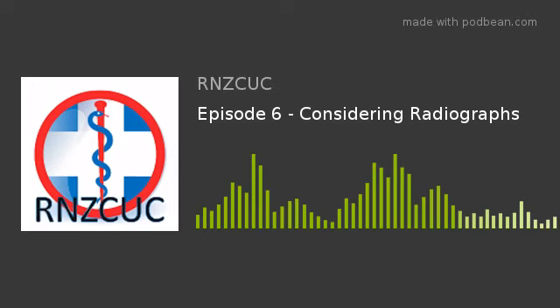And that goes back again to good analgesia and preparing the patient for the view. So if we say to them when we're examining them, can you bear weight on this? And they obviously can't, there's probably no point in sending somebody round for a weight-bearing X-ray. But if they can give a couple of seconds of full weight, we're going to get the pictures we need and potentially move that case forward in terms of diagnosis.